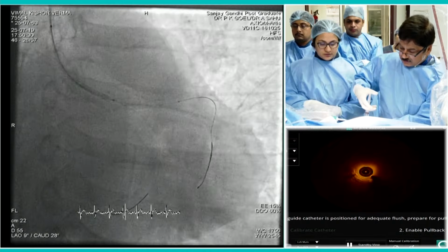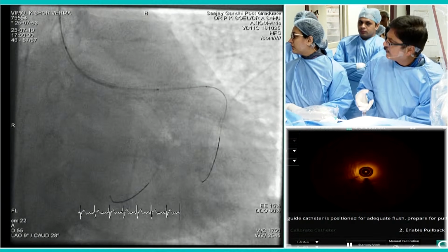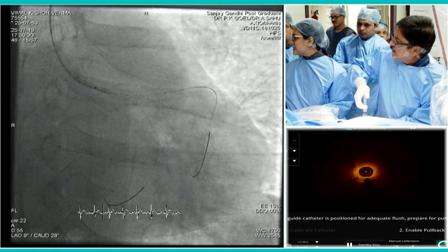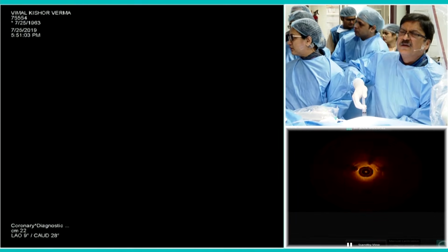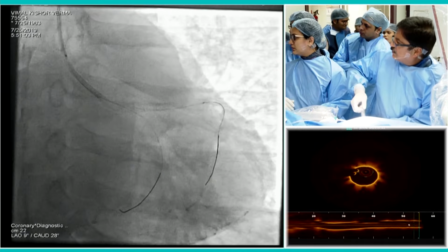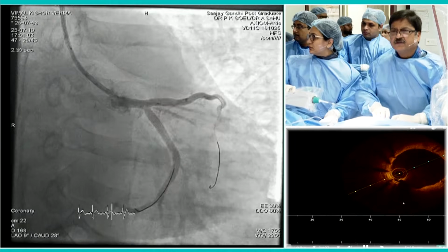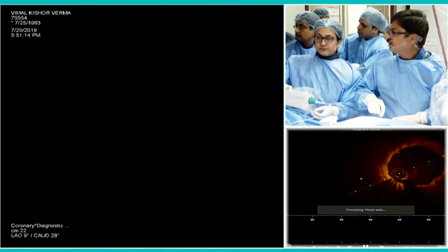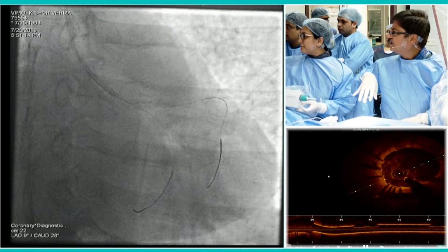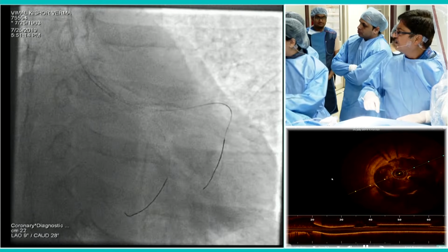Yeah, tetraspan. You are taking that now, injecting? Yes, sir. It's tetraspan only we're injecting, sir. All the runs we did with tetraspan only. Okay. Ready? This is the co-registration, because it's acquired in the OCT, merging the OCT information with the angio, and it's actually the best way to look at the real situation after stenting.